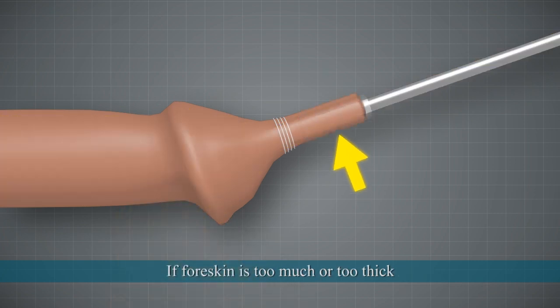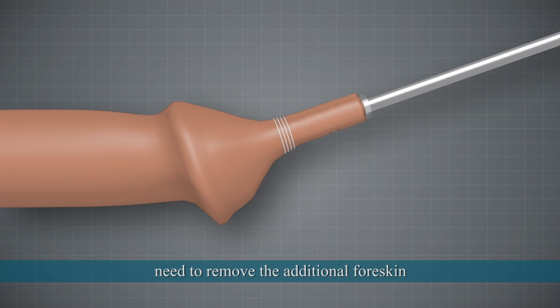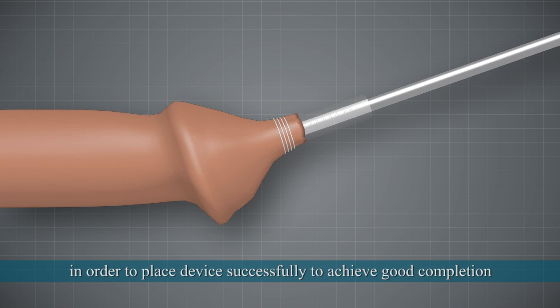If the foreskin is too much or too thick, remove the additional foreskin beyond the binder first in order to place the device successfully and achieve good completion.